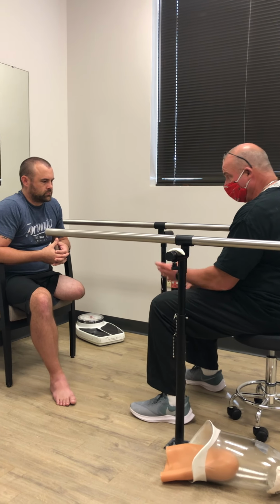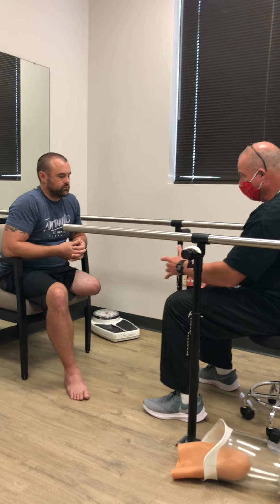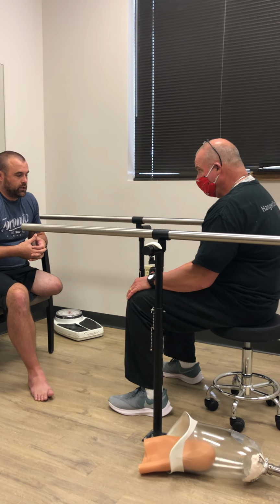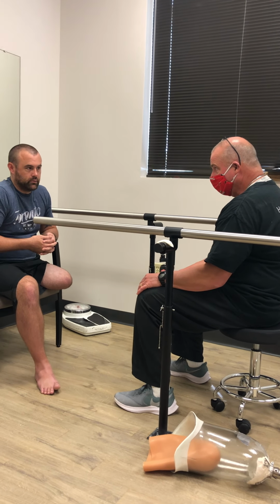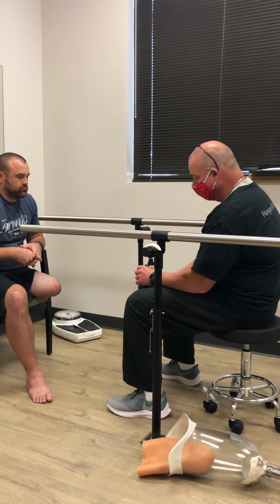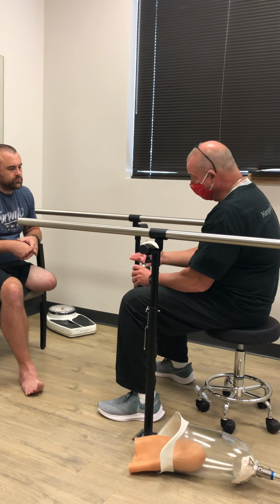Whereas if you get a good heel or a steel-toed boot, or even a low quarter, they're weighty. My boots were 5 pounds a piece. So you're looking at a pendulum effect. You're putting that on the end of a single axis joint, basically.